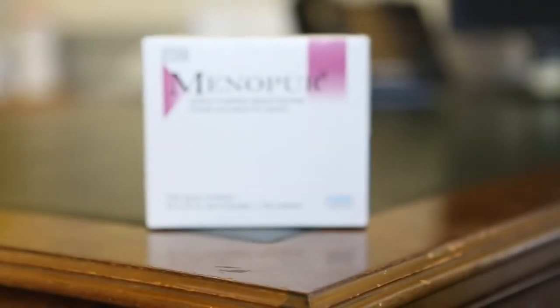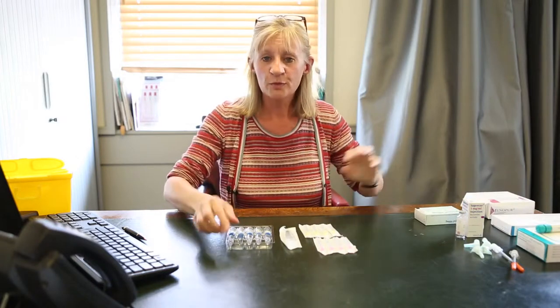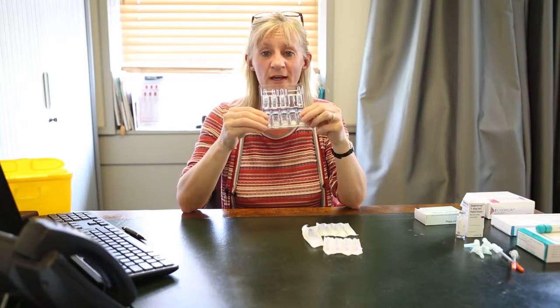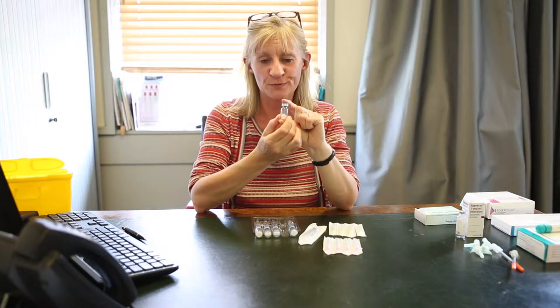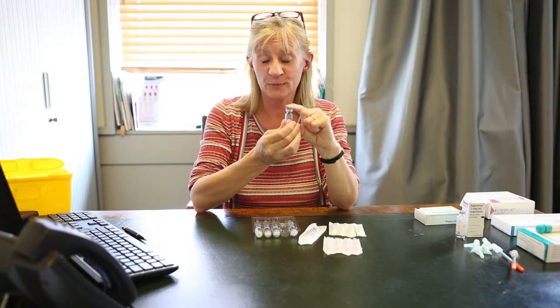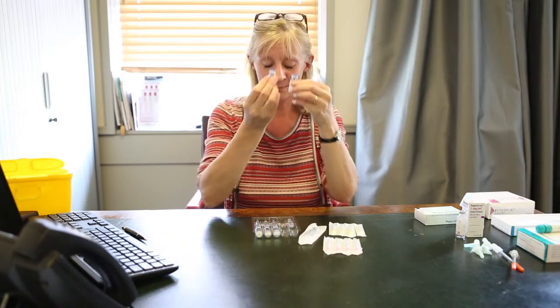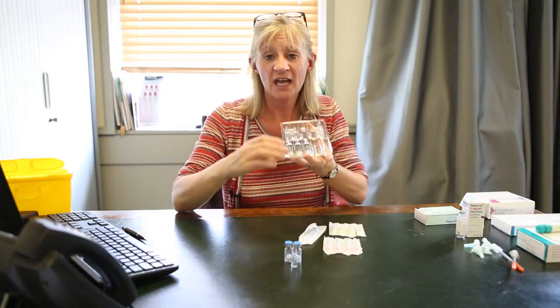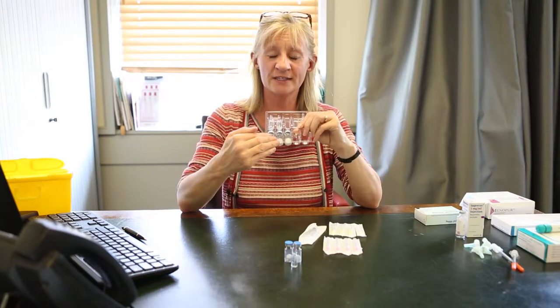I'm now going to show you how to use the drug Menopur. Some women are given Menopur, some women are given Gonal F. There is very little difference between the two of them, and your consultant would have given you the one that's going to suit you best. Menopur comes in powders and liquids, and each of these powders contains specifically 75 IU of FSH, and you will be given a set dose that you need to take — this may be 150, maybe 225, it depends upon how you may respond. For example, for 150 units we need two powders. You're provided with a lot of liquid, but you only need one liquid for those two powders — even if you're going to be asked to inject up to six powders, you only need one liquid, because all of those powders can dissolve into one liquid.